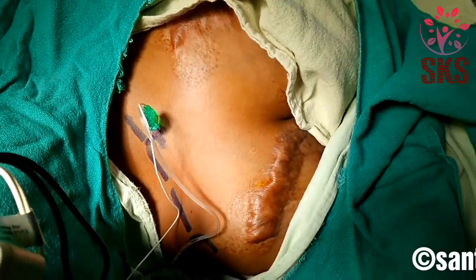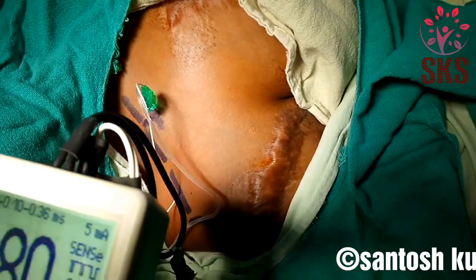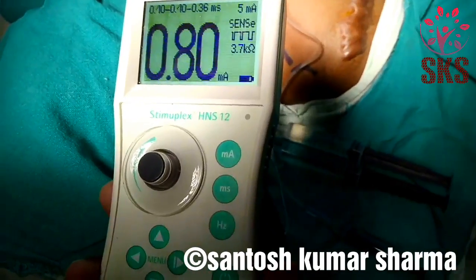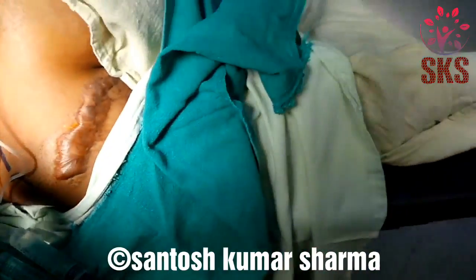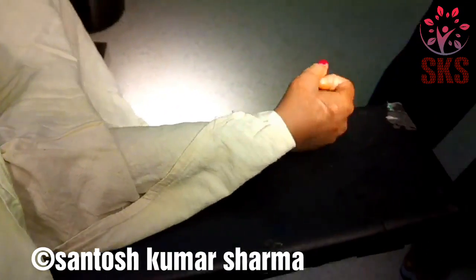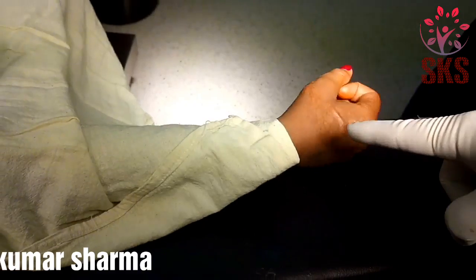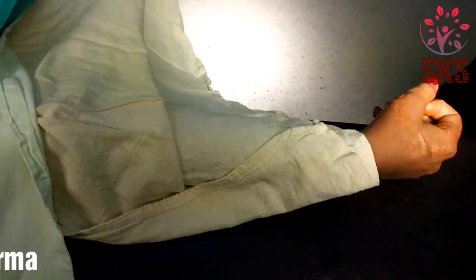Vertical infraclavicular block, 5cm needle. Current setting at 0.80. We are observing contractions — finger flexion as well as wrist flexion. This is at 0.8.